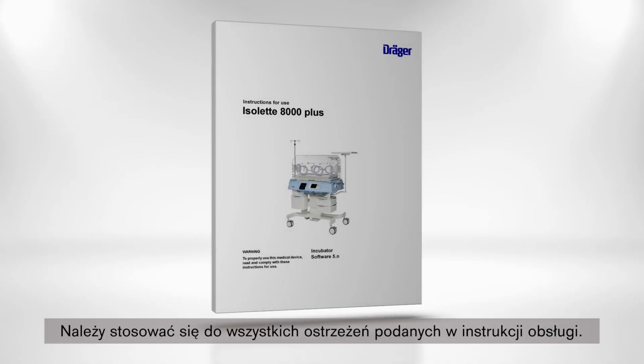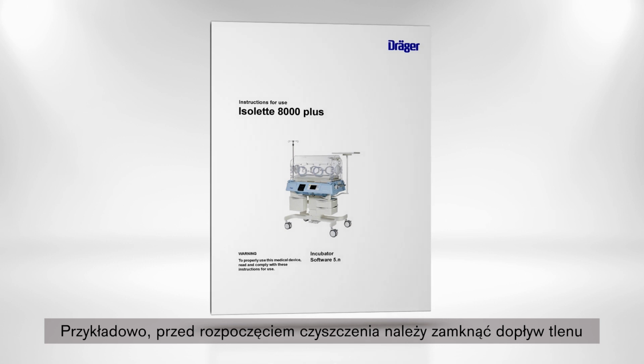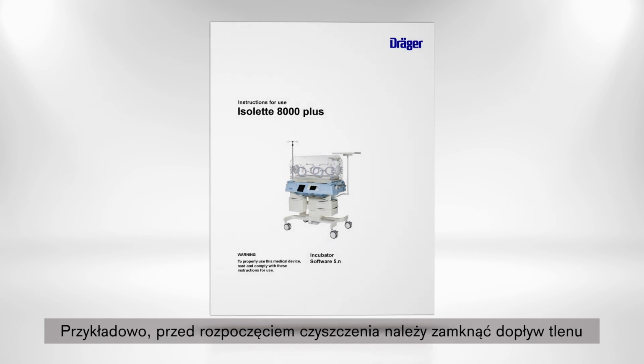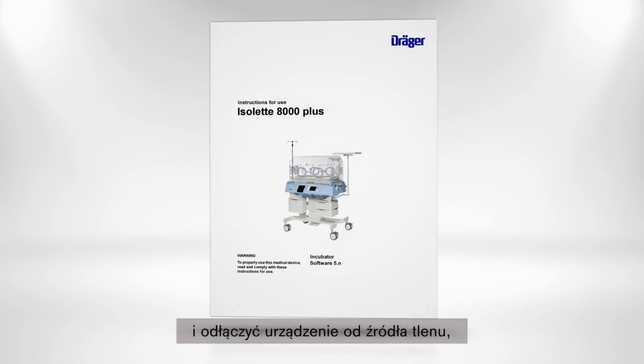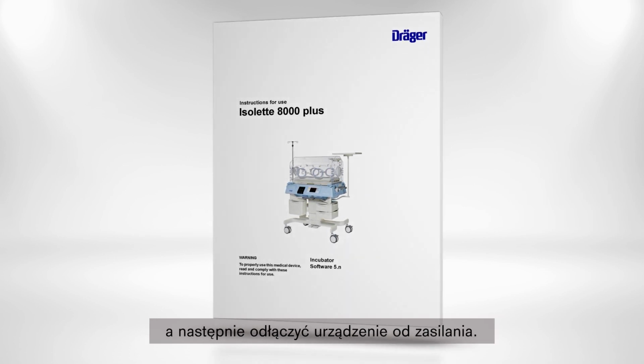Observe all caution and warning statements in the user manual. For example, first, confirming the oxygen supply is turned off and the equipment is disconnected from the oxygen supply. And second, unplugging the device from its power source before cleaning.